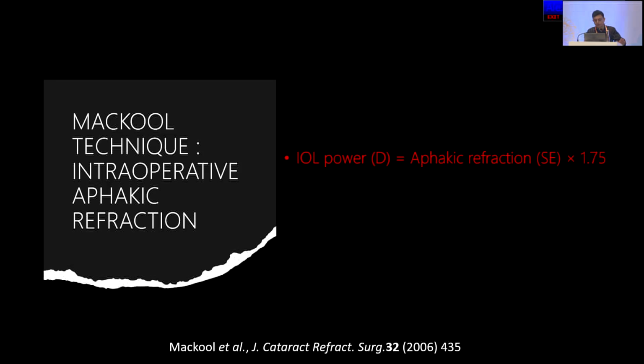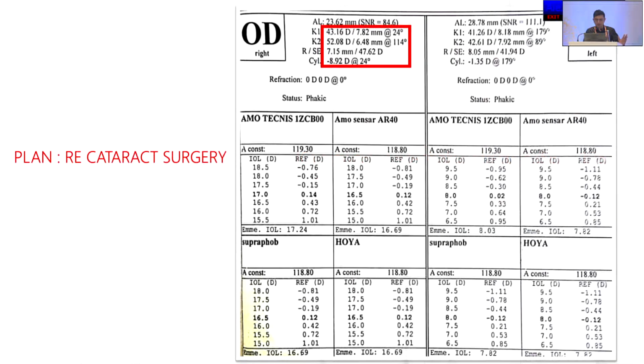After 1 or 2 hours, they take a refractive correction. What is the spectacle correction? A good optometrist will do it, and we multiply by 1.75 for plus power. That's what we go with, the formula. It works very well. You don't need to worry about effective lens position.